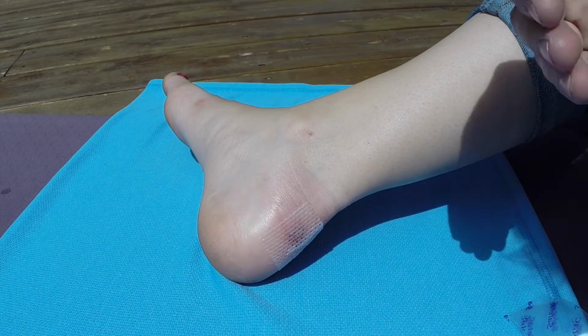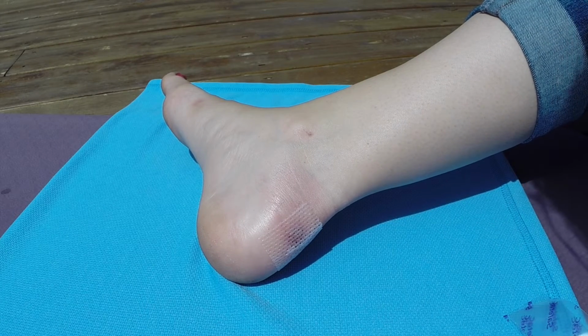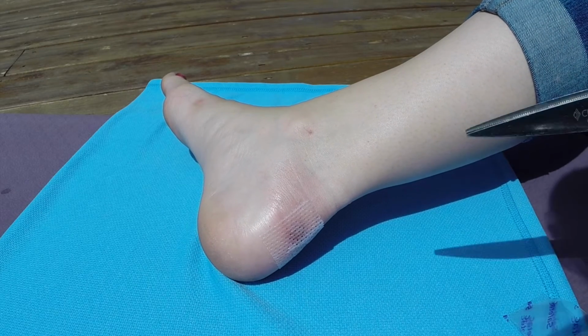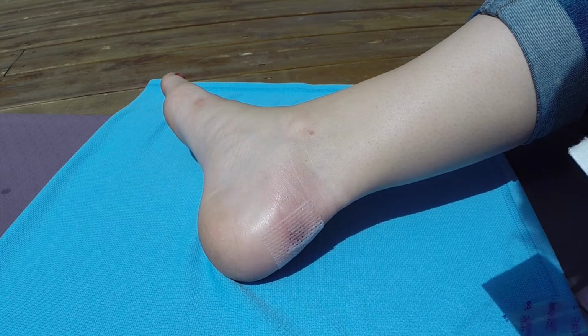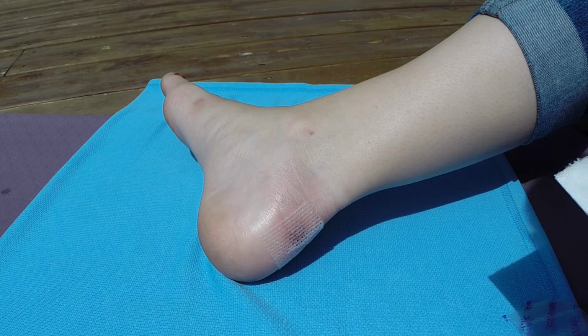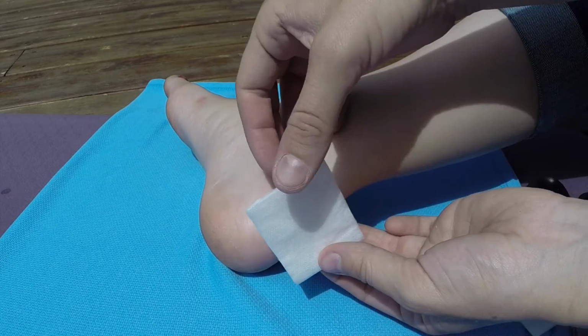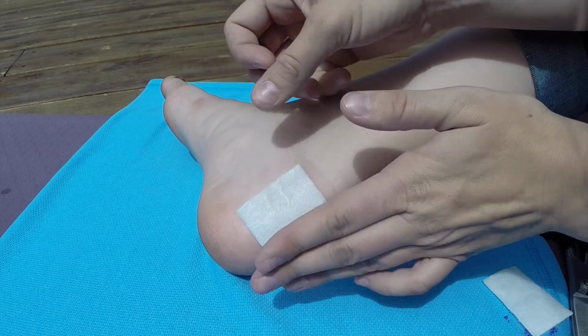Alright, so the next step is we're actually going to put an absorbent dressing in there. The Mepital itself acts as a perfect layer for next to the skin. However, it's not absorbent. So you've got some holes in there which are going to allow for drainage. And what we're going to do is we're just going to cut a non-adherent antimicrobial dressing just to go over the Mepital. So that'll do just like that, and we'll place it as a second layer.